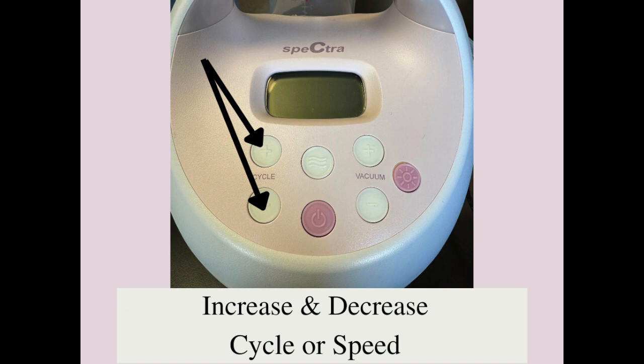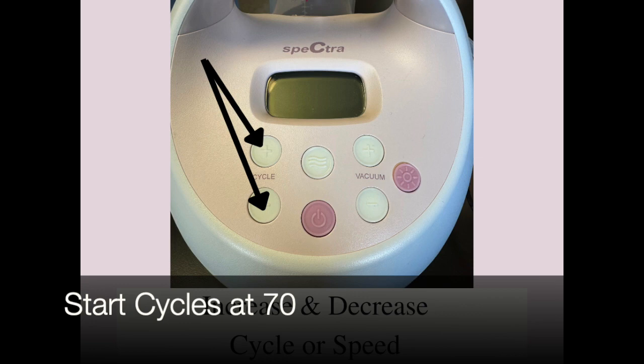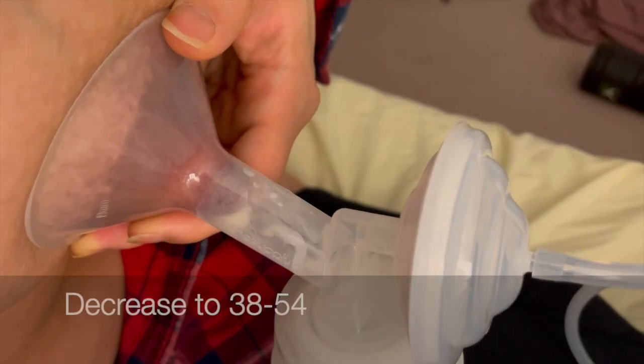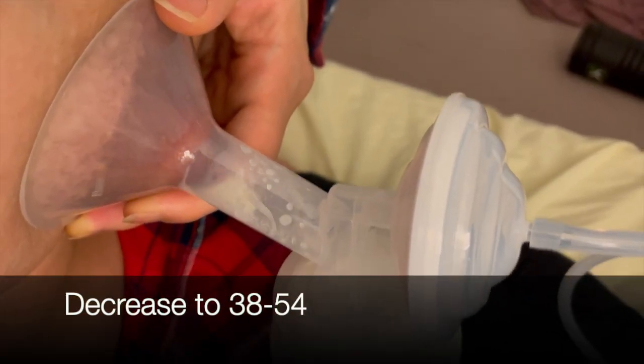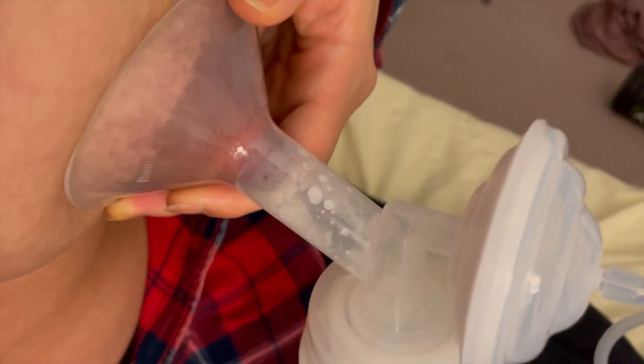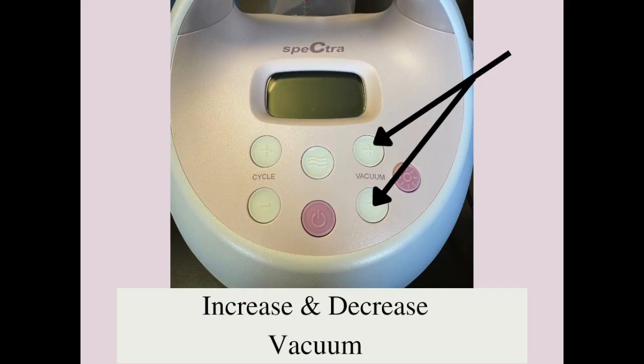The two white buttons on the left adjust the cycle — this changes the speed of the sucks. When babies nurse they start suckling quickly at first and as the milk flows the suck slows. You want to mimic the baby's suck so you start at 70. Once the milk starts flowing you can decrease it to 38, all the way up to 54. Some people go back to the faster setting once the milk flow starts to slow down.